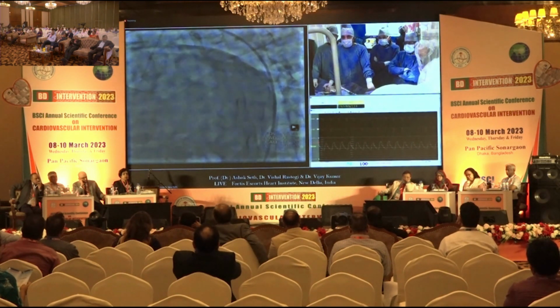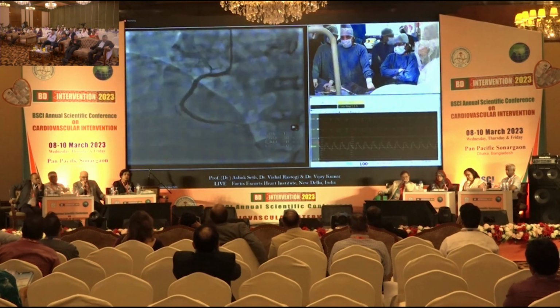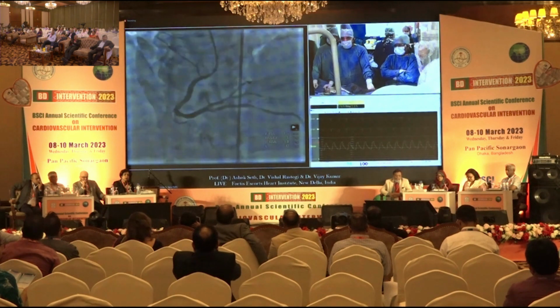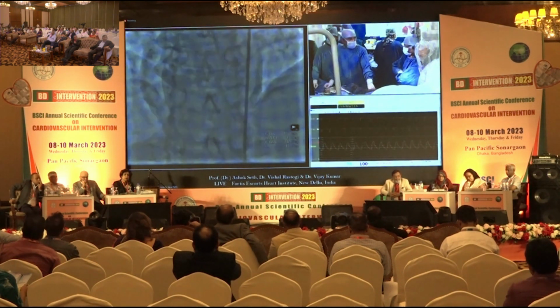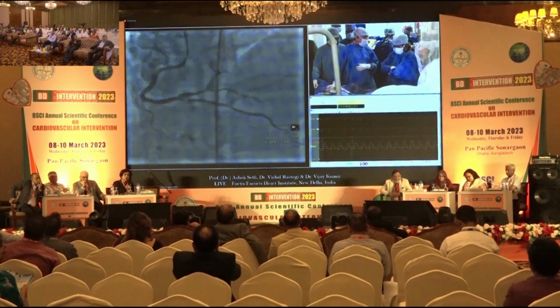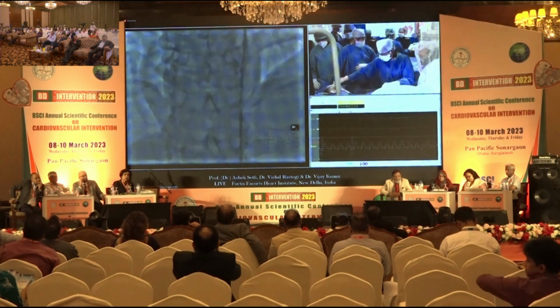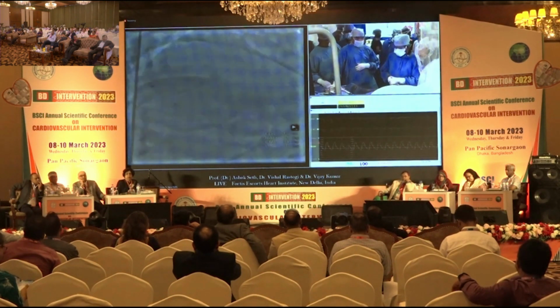And let's go to the right coronary artery. The RCA has a very large PDA with a high-grade stenosis. The SYNTAX score is 26. And the SYNTAX II MACE for CABG is 6.8 and for PCI 4.8 at 5 years. So over to you for this discussion.